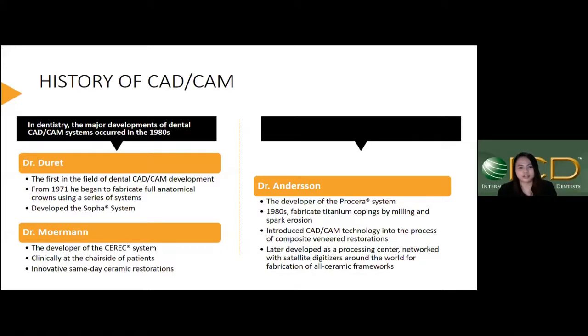There are three pioneers who developed the CAD/CAM systems. First is Dr. Duret. In 1971, he began to fabricate a full anatomical crown using a series of systems, and he also developed the Sopha system. The second one is Dr. Mörmann, the developer of the CEREC system. He focused more on the chair-side CAD/CAM system that you use in the dental clinic, and he also introduced innovative same-day ceramic restorations.